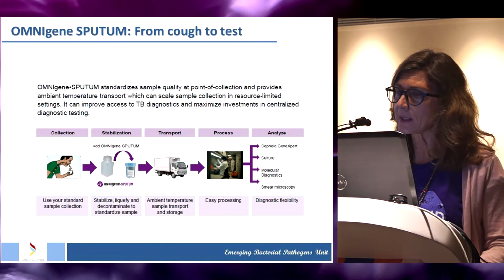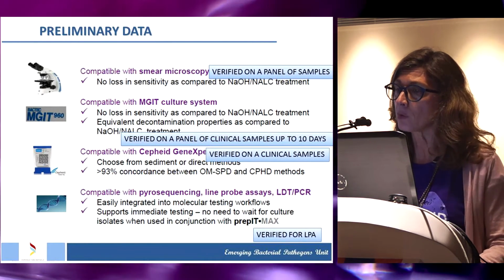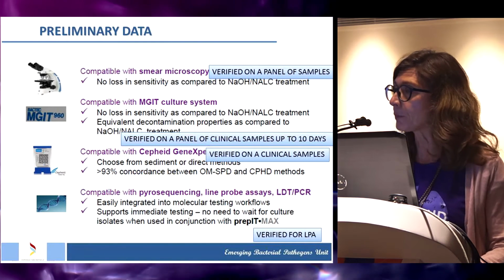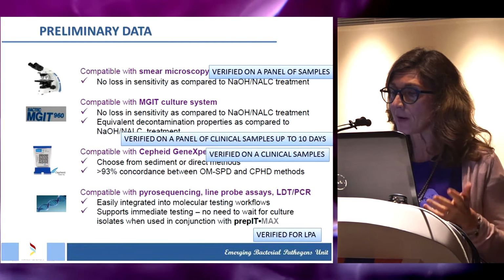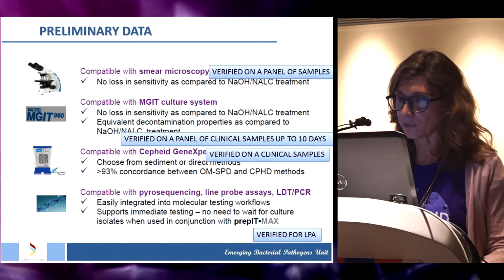We have evaluated this product very preliminarily, and we found that it is in effect compatible with smear microscopy. It is compatible with culture in MGIT up to 10 days of storage at room temperature in my laboratory, has been verified on Xpert, and is compatible with LPA. We haven't done WGS for now.